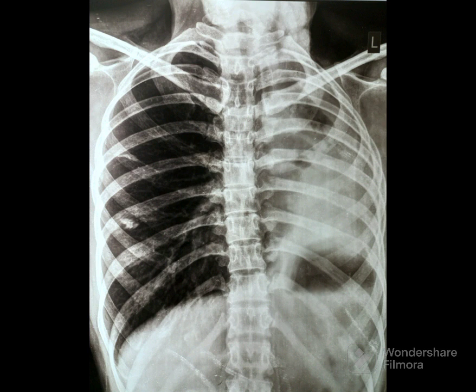There is hyperinflation on the right side. There is herniation of the right lung beyond the midline into the left hemithorax. So, there is volume loss on the left side.